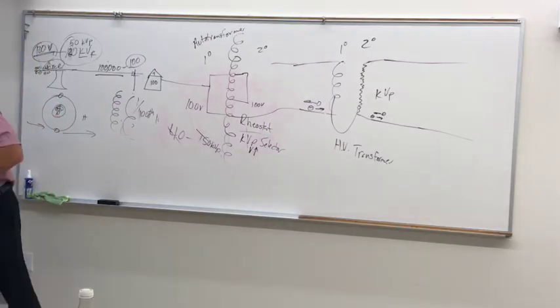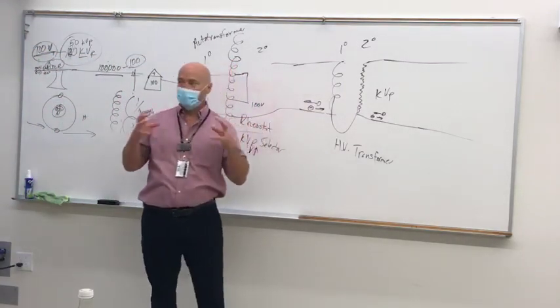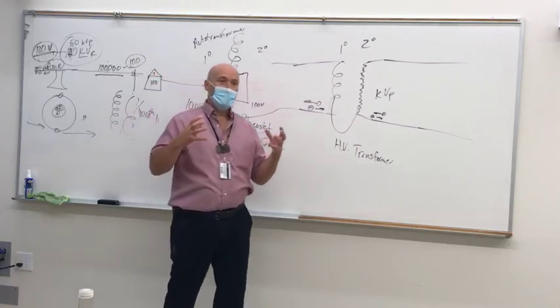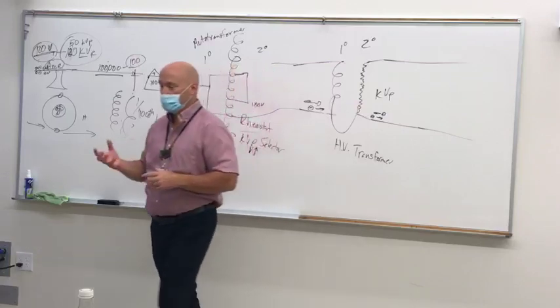Inside of the x-ray tube, you've got a lot of different components. And that x-ray tube is just a glass vacuum tube. It's a high dollar, complicated light bulb is all it is. But it's got different components.